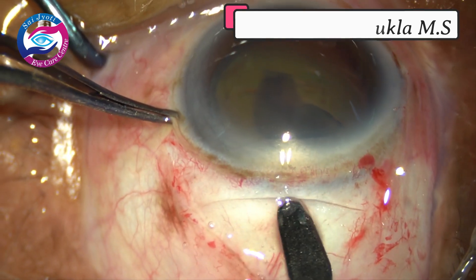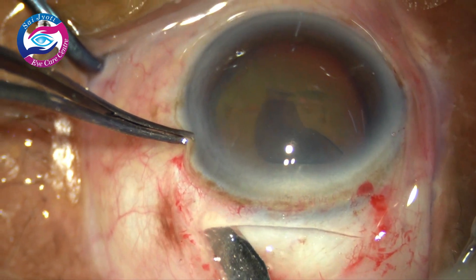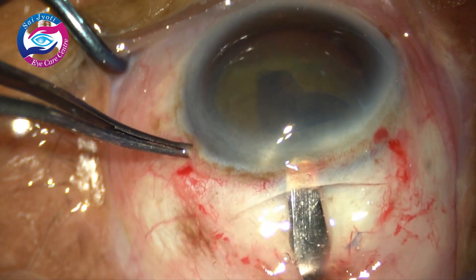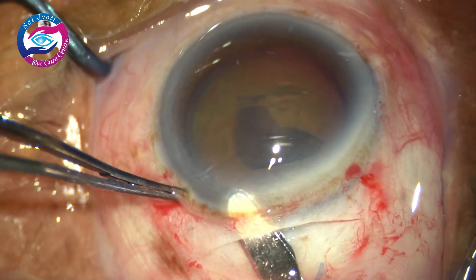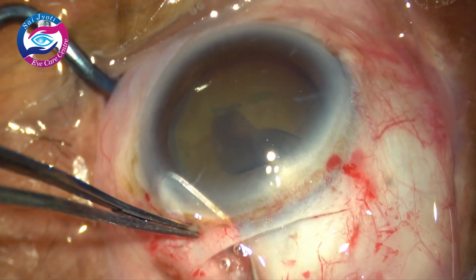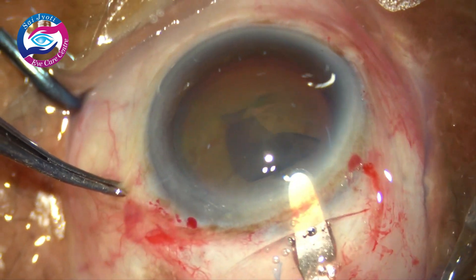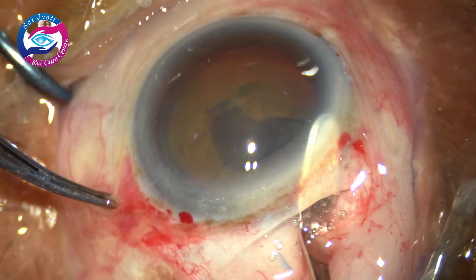By this time the capsulorhexis has already been done through the side port and I have made a partial half to one third thickness scleral groove. The ends of the scleral groove have already been marked using a crescent. Now the crescent is entering the corneal stroma. The bevel of the crescent is slightly moved upwards so that we don't have a premature entry. It is always a good idea to hold the eye at the limbus and try to pull the eye slightly downwards so that the bevel always remains up. The tunneling is started in a wriggling motion of the crescent.